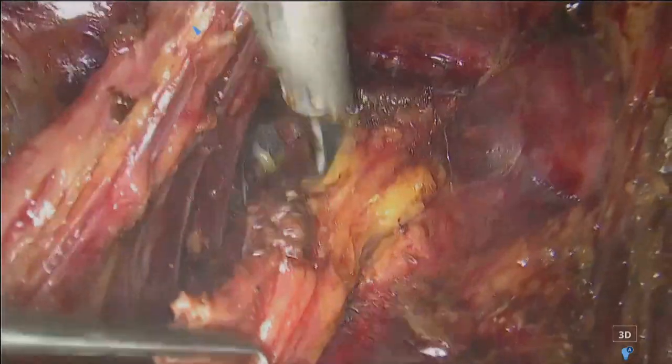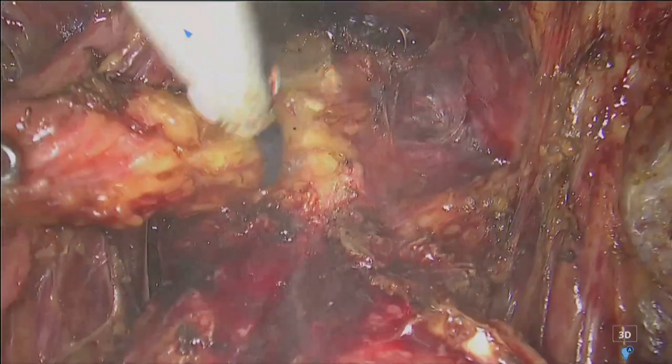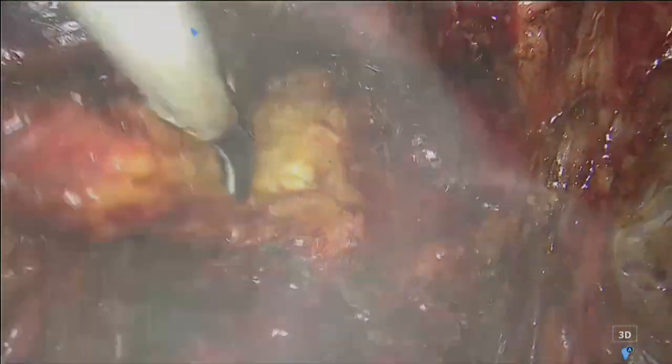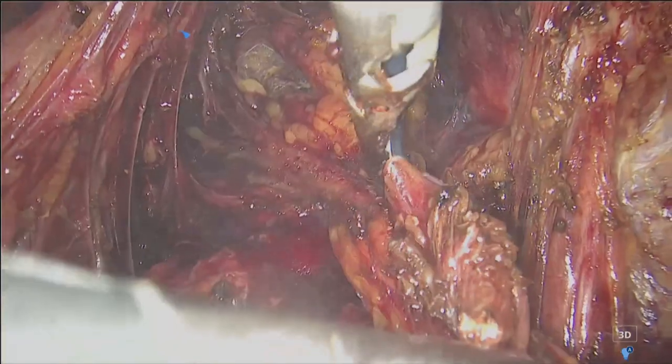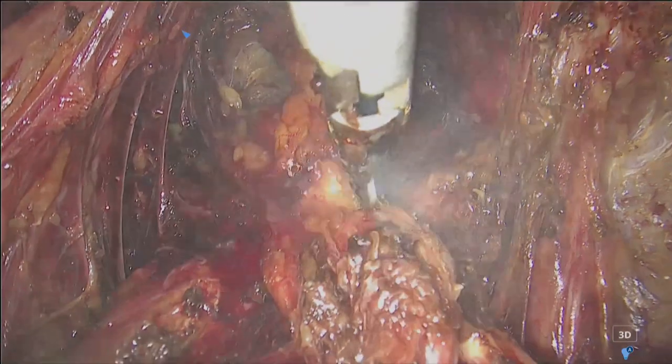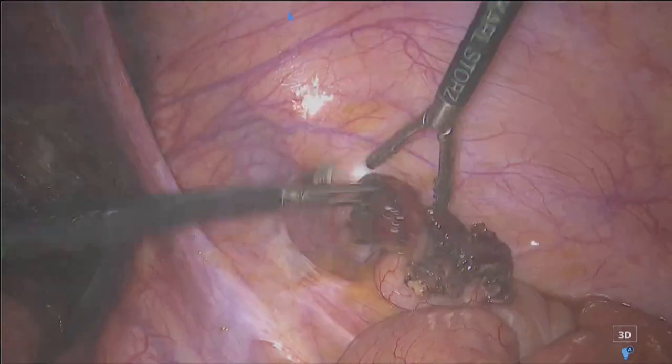And so with this shaving, we can resect the rectum more cranially, because here there is no deep infiltration. It's only infiltration of the fat tissue. Okay, so removing this superficial part, now we can really go to prepare the area of resection.